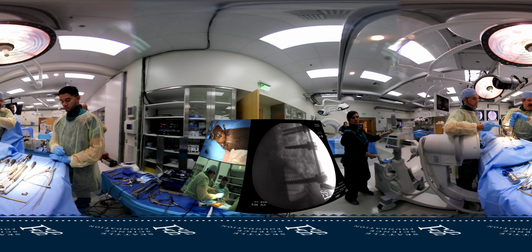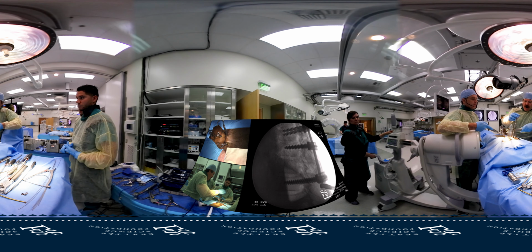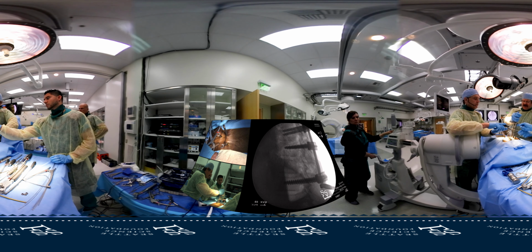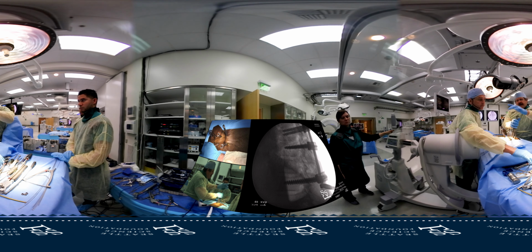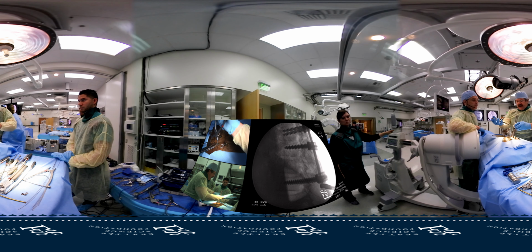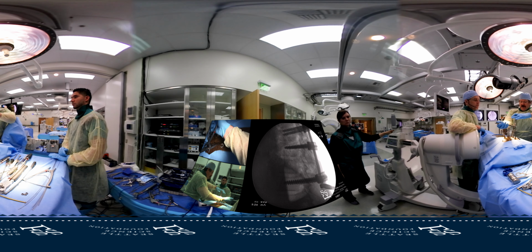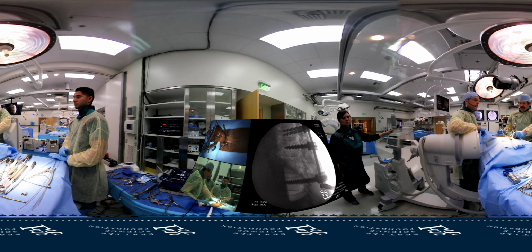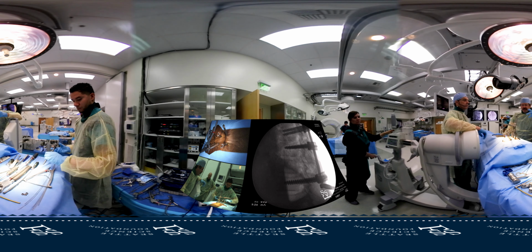The other way to do that, do we have a cob? Let me see a cob. The other way to do that is to take a cob or something out here behind where we're going to compress, and then we can hold it apart that way. And so we would compress on the outside like that. That's how a lot of systems work. This particular system, it sort of does it for you, and then it puts the compression distraction device out here, and then rather than get the compression between the ends of the cannulas, it puts it down onto the screws. So you have to have something that blocks these from coming together. Depends on what system you're using.